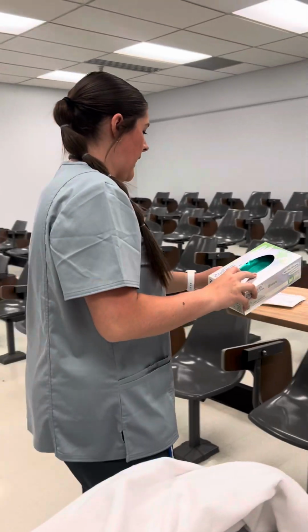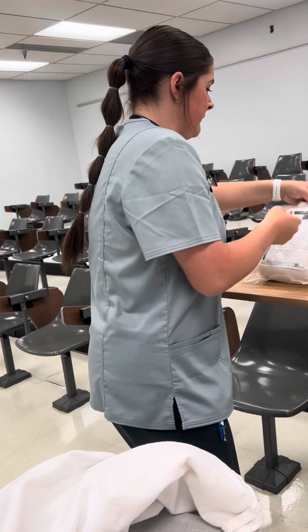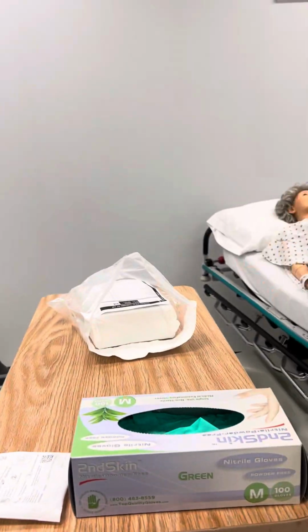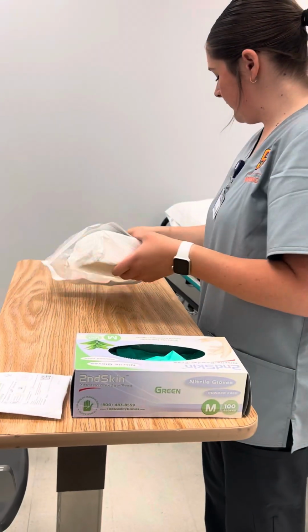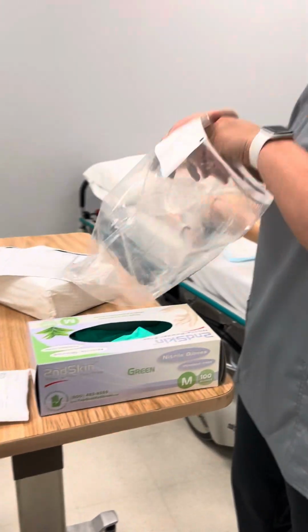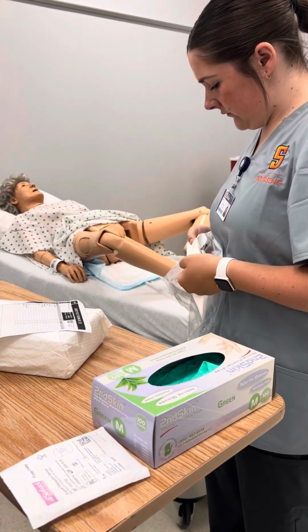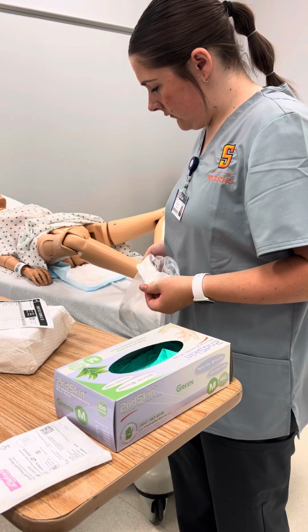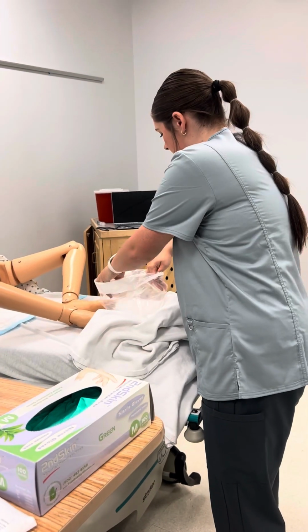Are you still doing okay, Glenda? Yeah? Okay. Open my kit here. I'm actually going to get rid of this so I don't break my sterile field accidentally. Just a little trash bag.